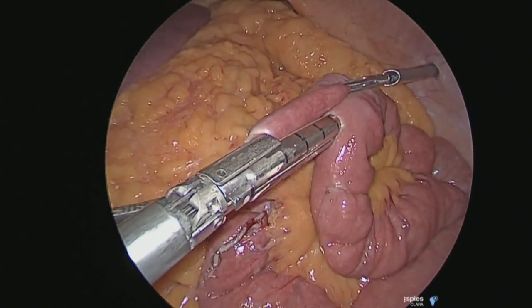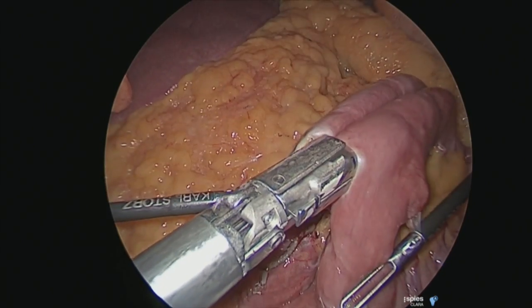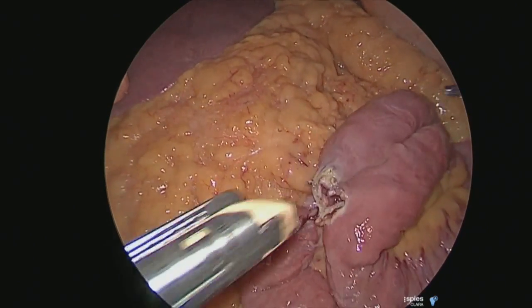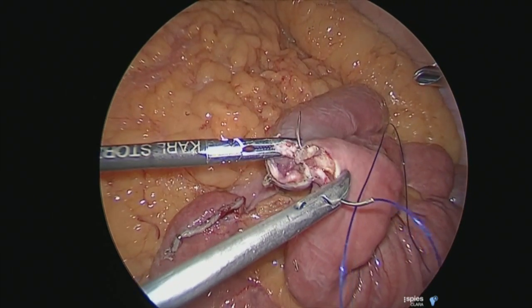If you're using a tri-stapler, you use a tan cartridge, or you use white staplers if you're using the other staplers. You always inspect inside to see if there is any bleeding and identify that bleeding at this point in time.